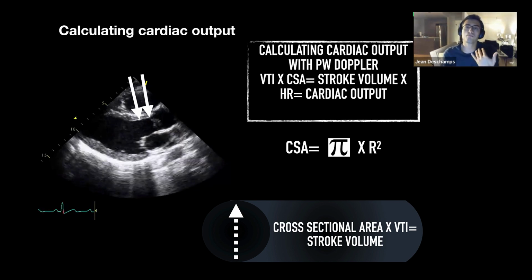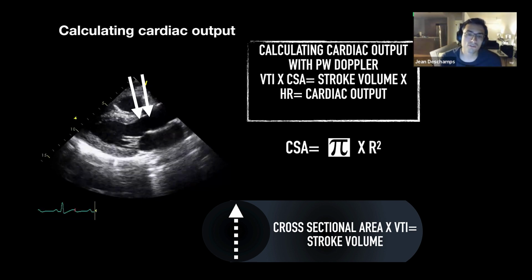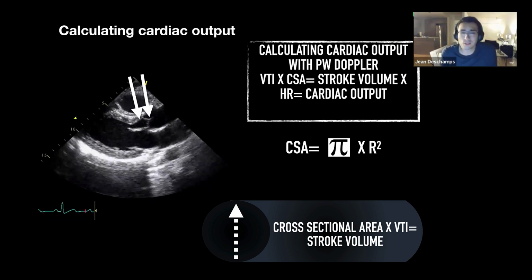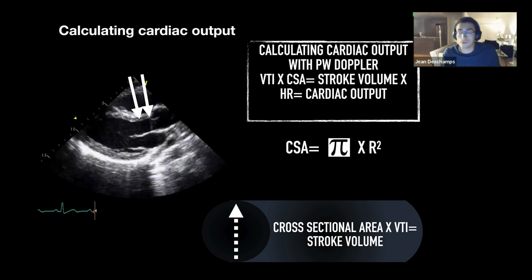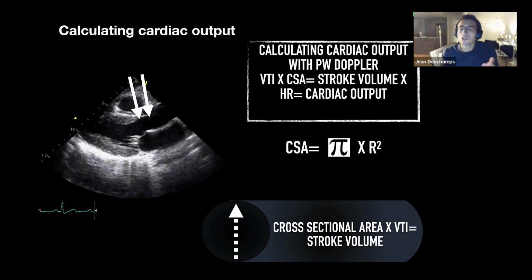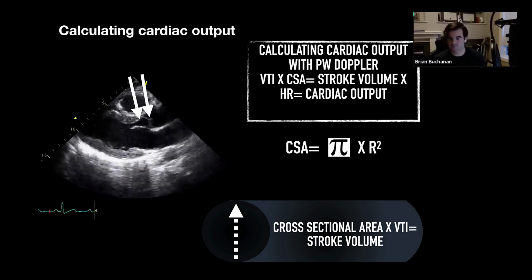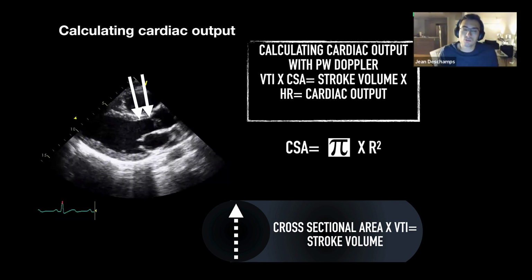If you look at body surface area and size estimations and rules for LVOT diameter, you end up realizing that most people are around 20 to 22 millimeters. There are extremes when they have pathology of the aortic valve or very small people, but these people usually you can see visually in the 2D and you can adjust for them. These are the ones I need to measure if I want to get something a bit more precise. That would be my argument in terms of measurements.